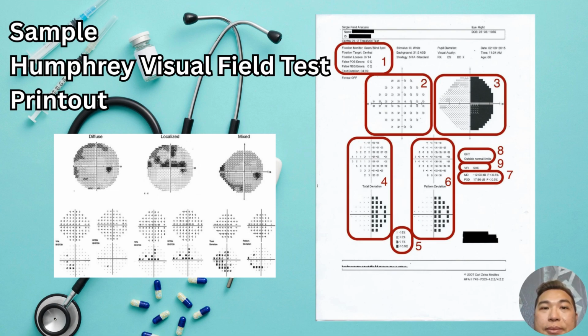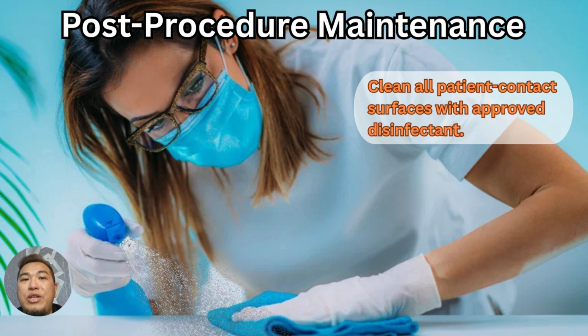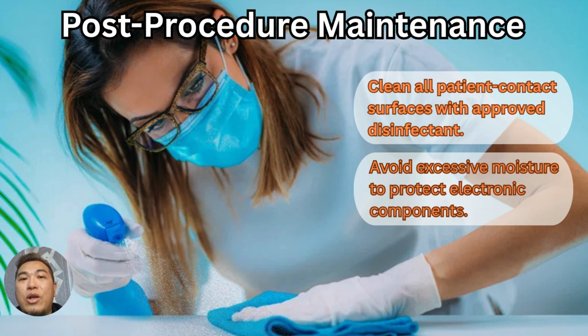After each test, we make sure the Humphrey Visual Field Analyzer is clean and ready for the next patient. We wipe the chin rest and forehead rest using a soft cloth with mild non-alcohol disinfectant, taking care not to use too much liquid to avoid excessive moisture that could damage the electronic components. The patient's response button gets cleaned with an alcohol wipe, and the outside surfaces are dusted daily with a microfiber cloth. Then check the trial lens.